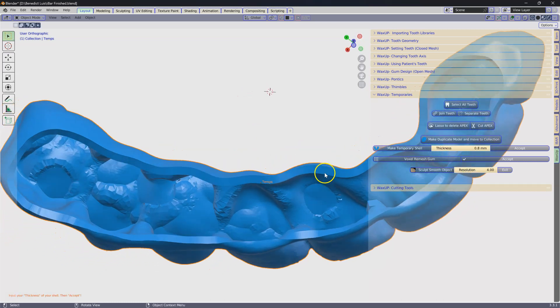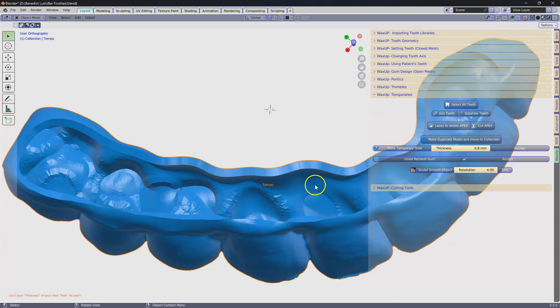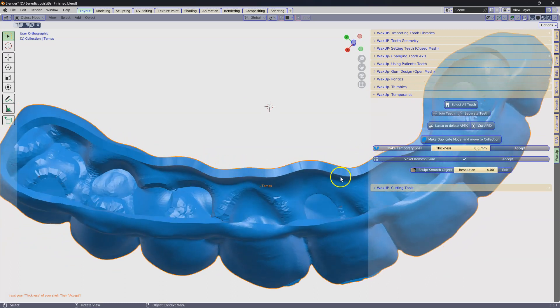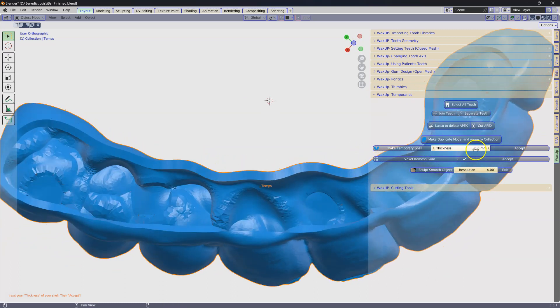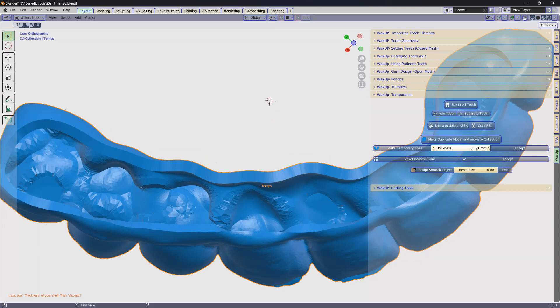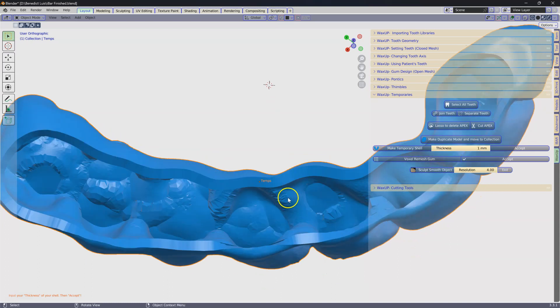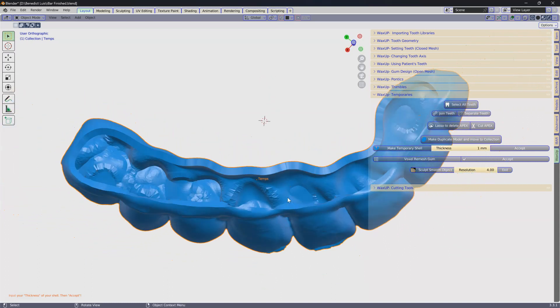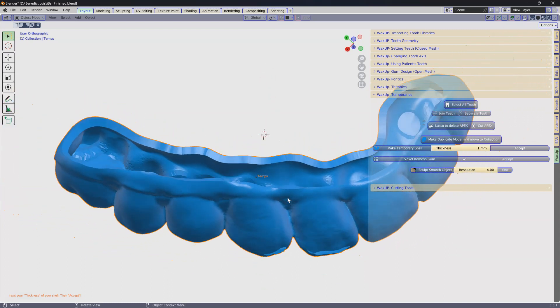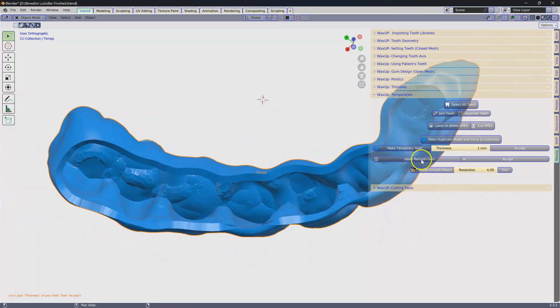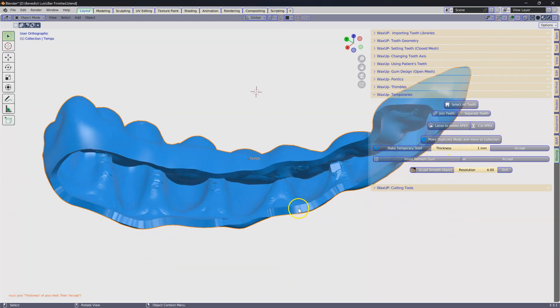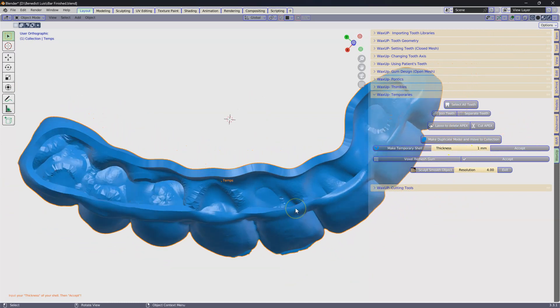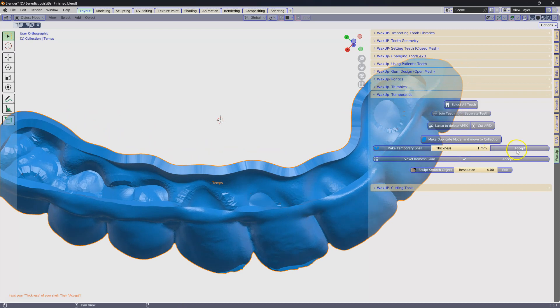This expands and gives us the opportunity to choose how thick you want it. If you think you can print it one millimeter, that's good. Put it in there. That depends on your printability. If you can make it thicker or thinner or whatever. Click on accept.